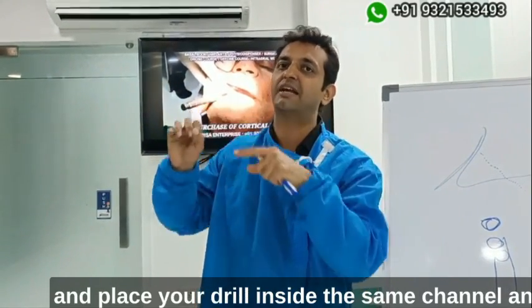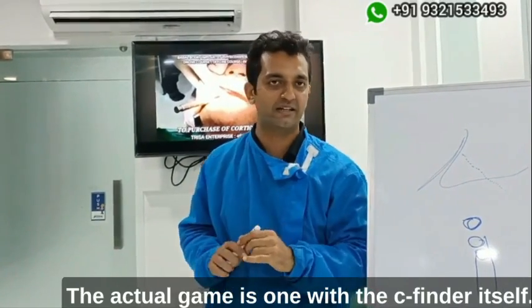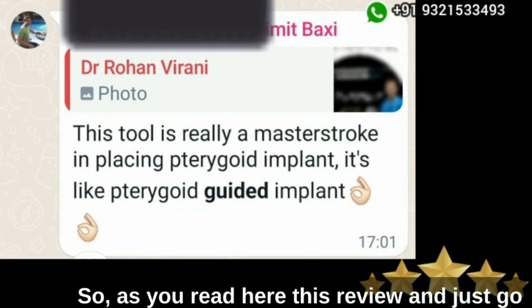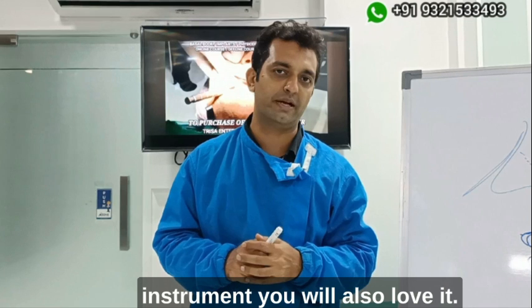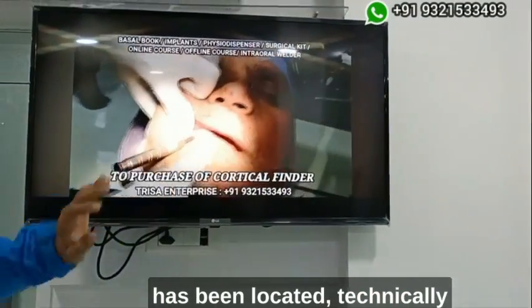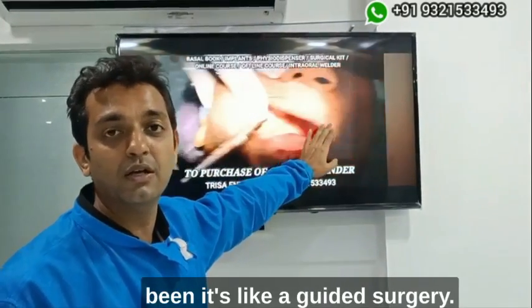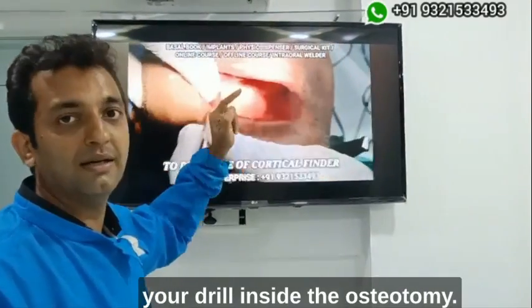The drilling remains a formality because the C-finder has already created a channel for you. All you need to do is remove the instrument, place your drill inside the same channel, and perforate the opposing cortical — it becomes a real cakewalk. The actual game is won with the C-finder itself. Here are two quick reviews on the C-finder that confirm this. Technically, your work for the pterygoid implant is over once the instrument has located the fusion zone — it's like guided surgery.